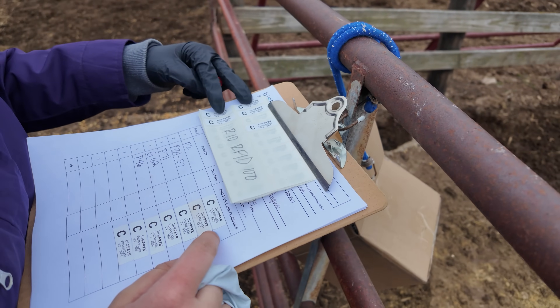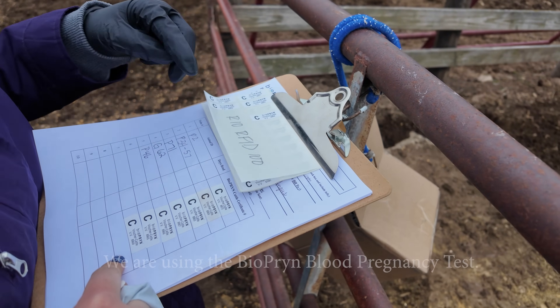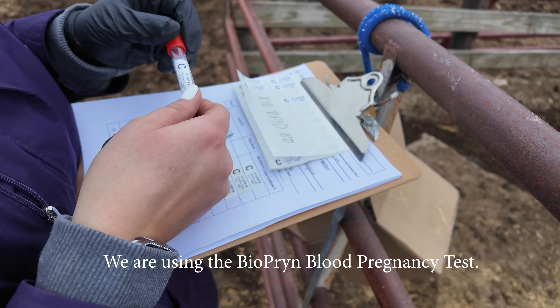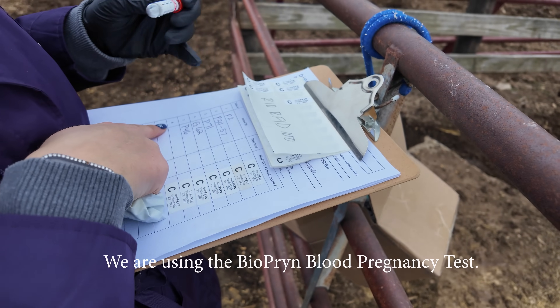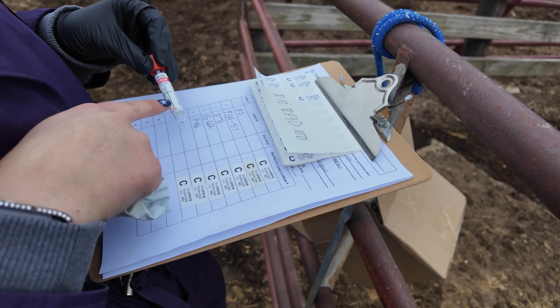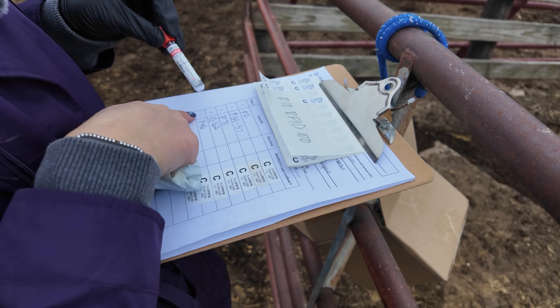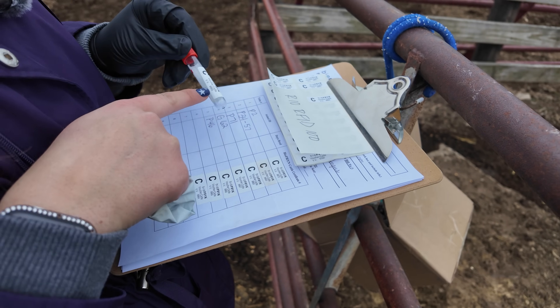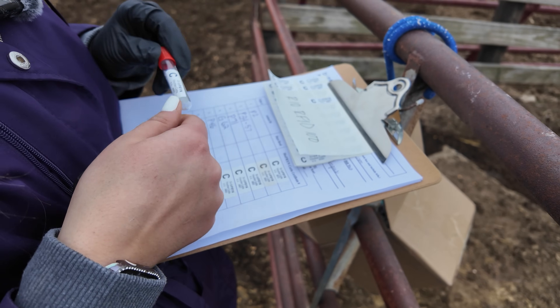They give you two stickers of each number. One goes on the paper where you write the animal's name, and then one goes on the tube where you also write which number goes with the tube, the animal tube number, and the animal ID. So there's no way you can mess it up.